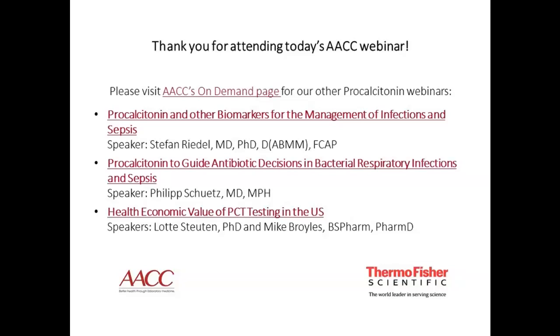So we don't offer it stat. We have a turnaround time in our hospitals of about an hour, that's in the lab. So turnaround time from acquisition, I would say in the 2 to 4 hour range is certainly useful.